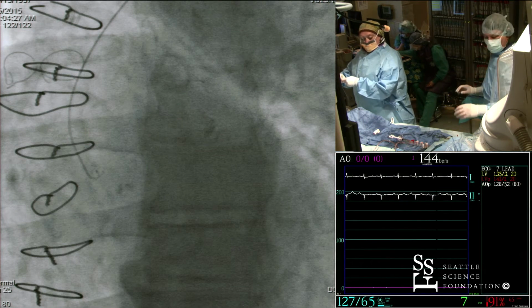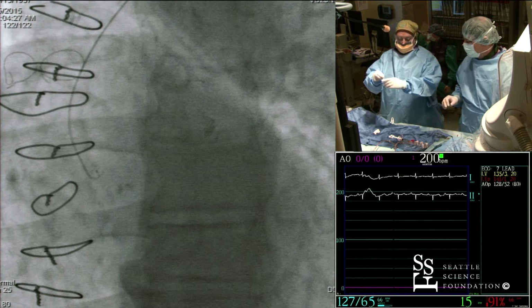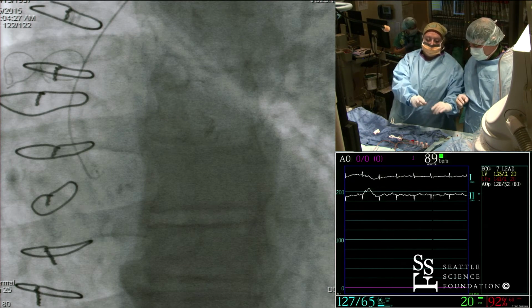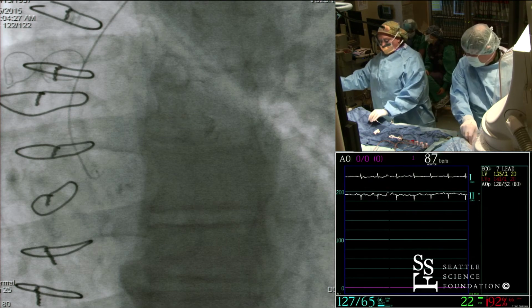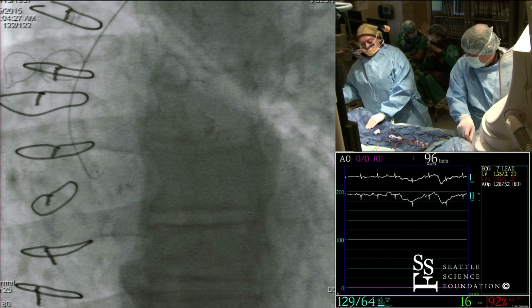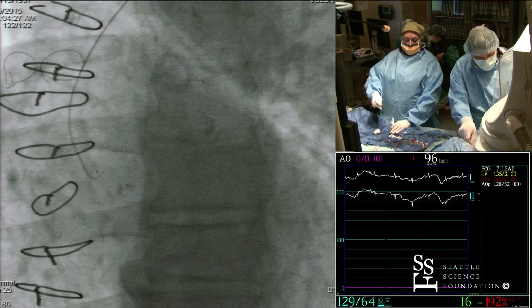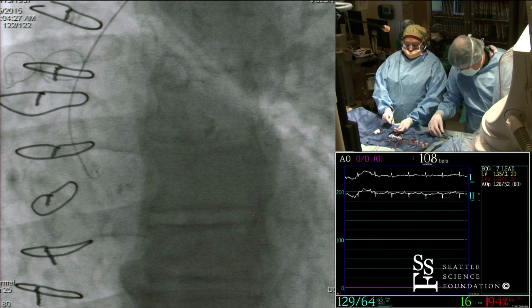I found useful the Ikari, which is a guiding catheter that allows you also engagement of the right and the left. I use Ikari for STEMIs because I save a catheter exchange. I can shoot the non-culprit first and then go to the culprit. Yeah. Sometimes it won't work. In about 30 to 40% of the cases, you're not going to be able to engage both vessels. At least you're going to engage one.